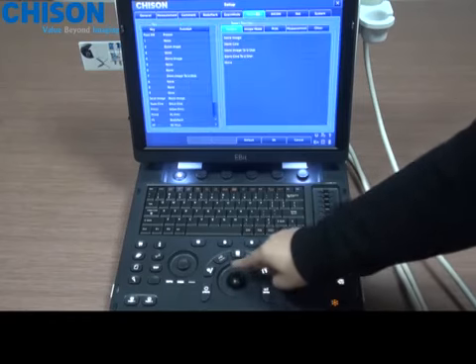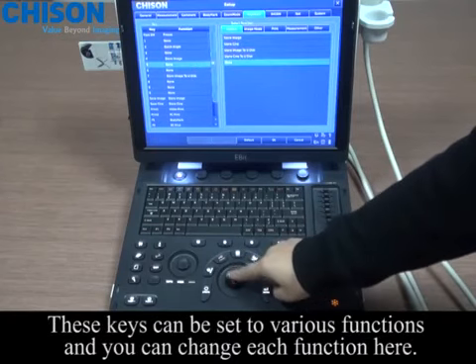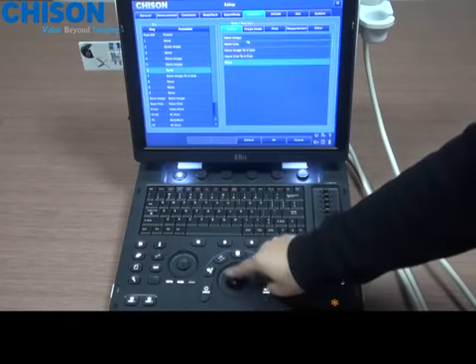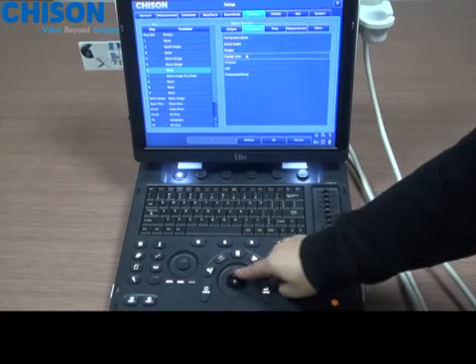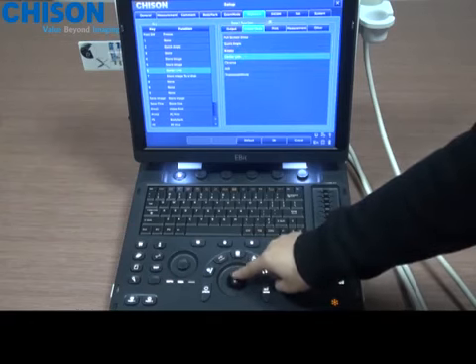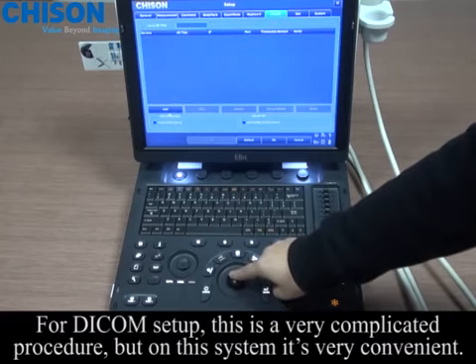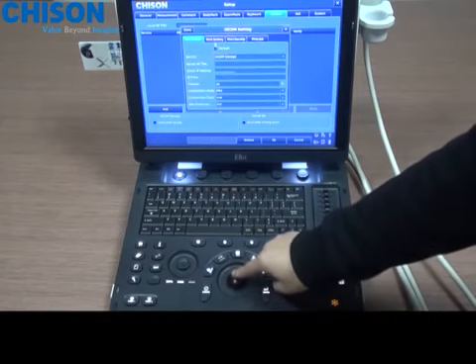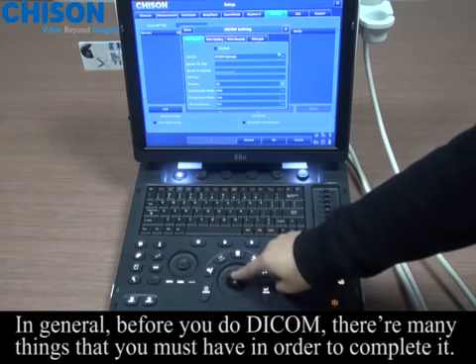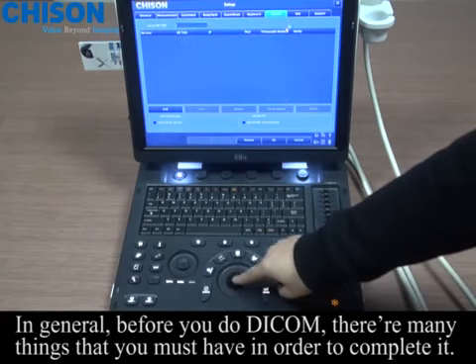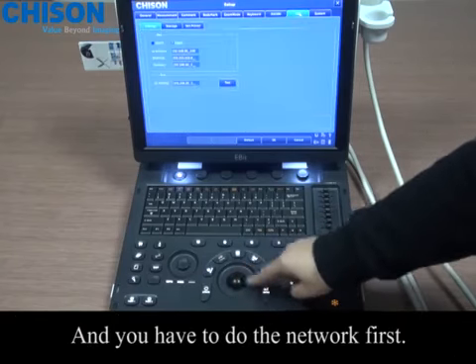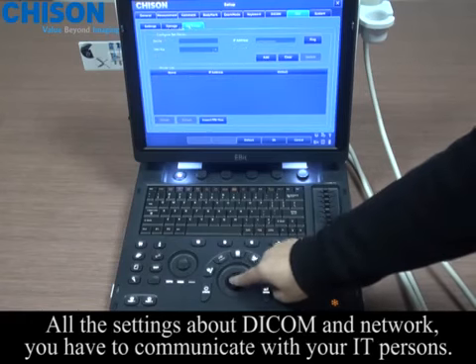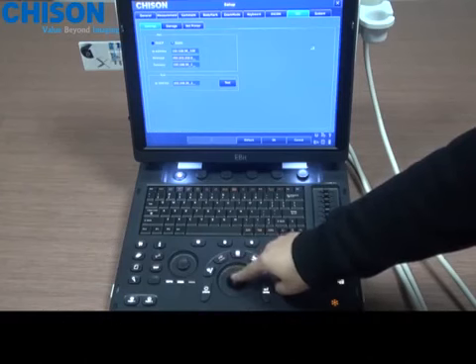You can also restart the system. These keys can be set to various functions and you can change each function here. For DICOM setup, this is a very complicated procedure, but on this system it's very convenient. Before you do a DICOM setup, there are many things you must have in order to complete it, and you have to do the network first. All the settings about DICOM and network — you have to communicate with your IT persons.